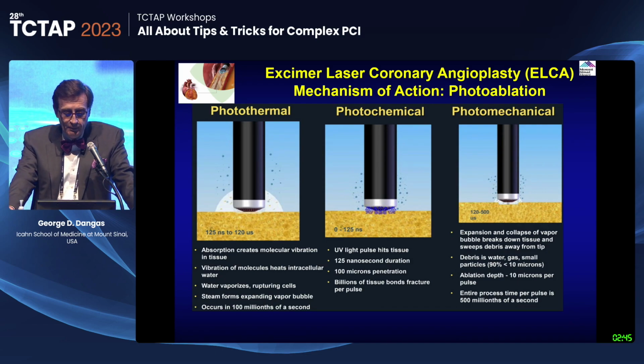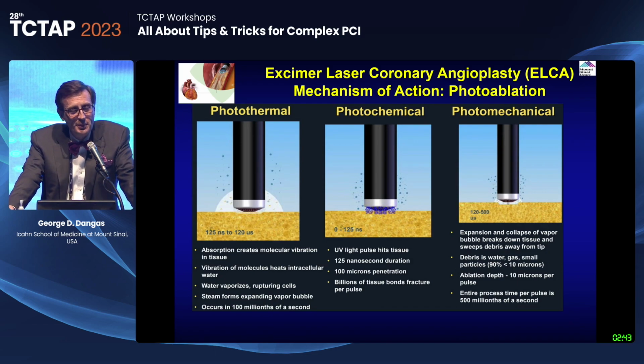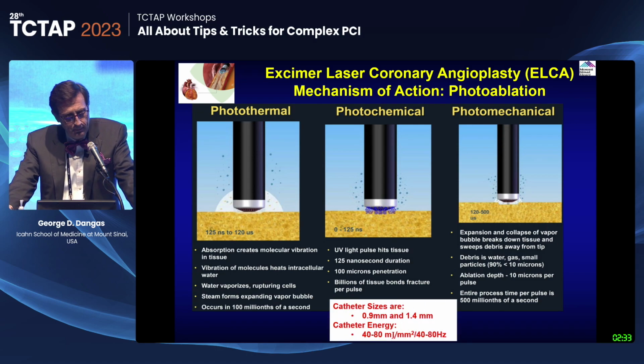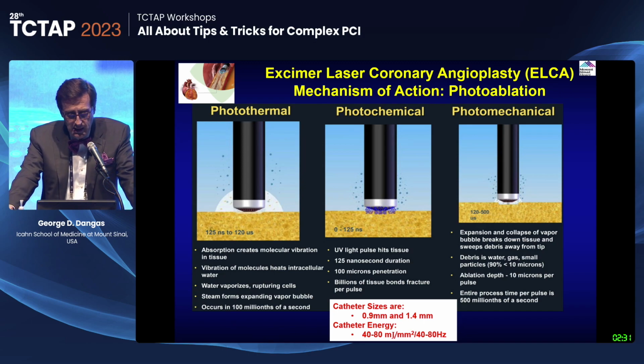Dealing with a laser, which is obviously perhaps even older than Gary's paper that he showed us before, laser is particularly good with thrombotic lesions, one could say, and that's how it started. If you combine it with a contrast injection at the right time, even the smallest laser can create some kind of a controlled or not so controlled bomb effect, a localized mini explosion, so to speak, and ablate the calcium.